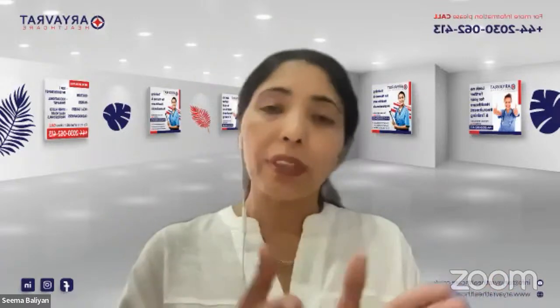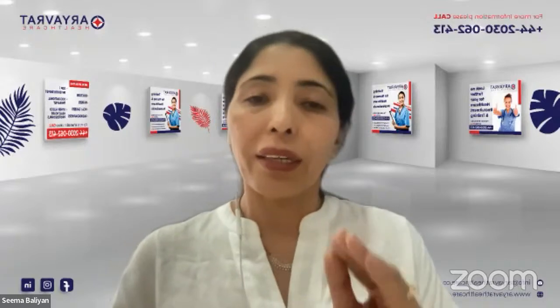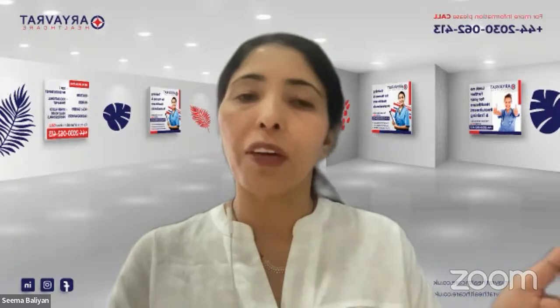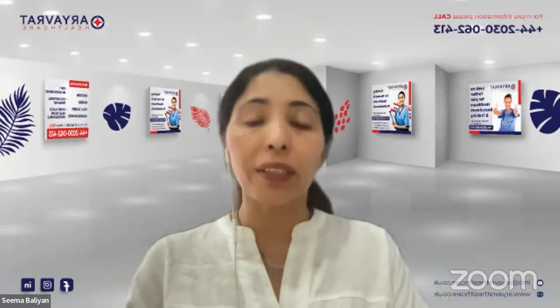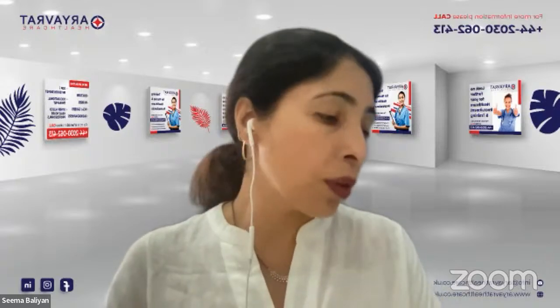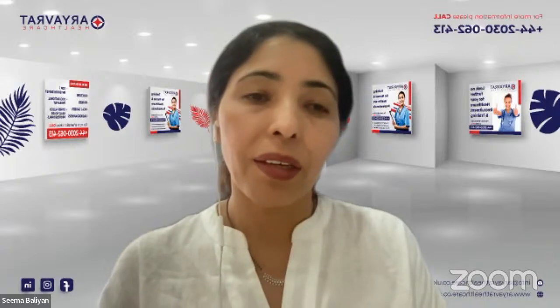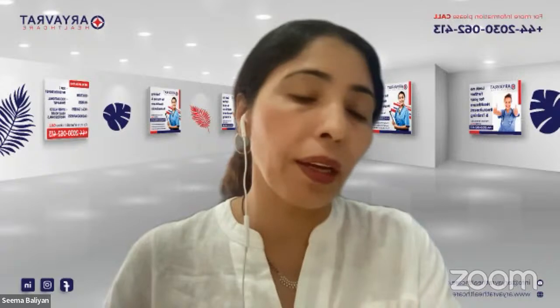Now we will start one by one. We will start with the teaching on this one, and I'm skipping the introductory 6 because we have already gone through that. So we are just going to start with what is an inhaler. Who is going to tell me the what and the why of the inhaler? Neha, do you want to tell me what is an inhaler and why we use the inhaler?